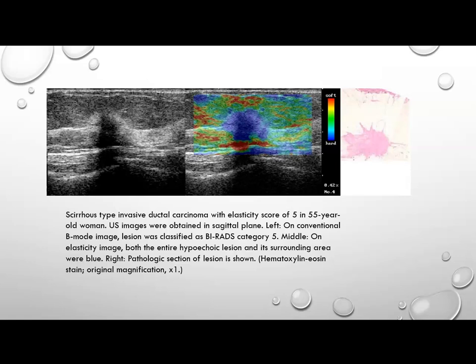And another thing that I want you to take away from this picture of the tumor is that when you look at it on grayscale, we believe that this dark area is the extent of the tumor. When we look at it on elastography, look how far out in these areas this tumor extends. So it suddenly extends much, much farther out than it did before.